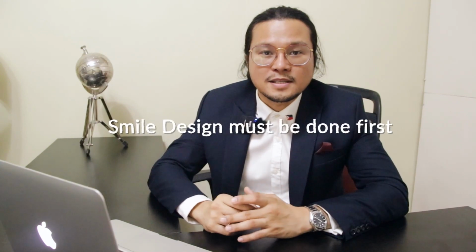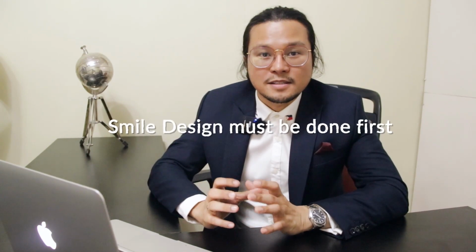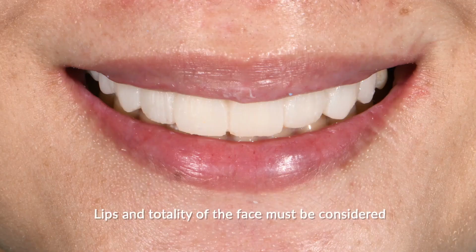So of course, before we do the teeth preparation, we have to make sure that we have secured the design suitable to the patient's case. So in doing a smile design, we're not just considering the exact sizes of the teeth, but also we have to consider the lips and also the totality of the face. And also, the patient requested for a natural looking color to complement the lower para hindi masyadong ganun ka-off. But she wanted a bit whiter than the original kasi mas bagay sa kanya.